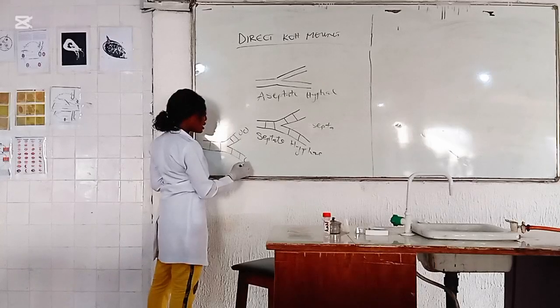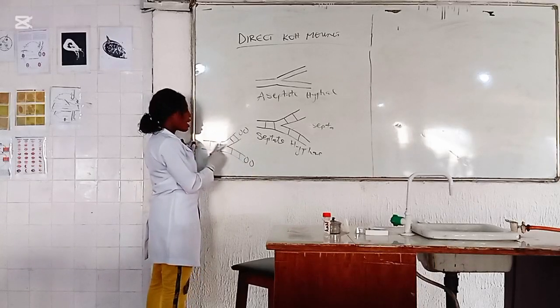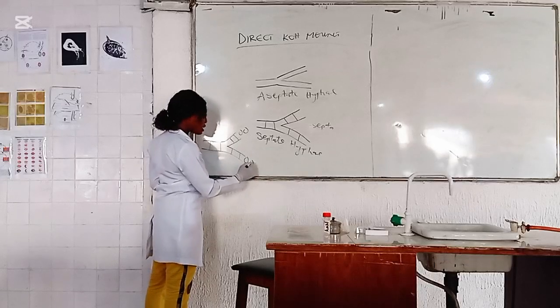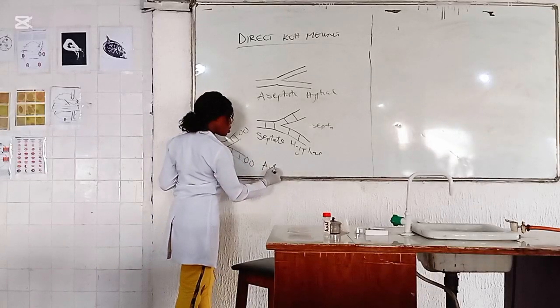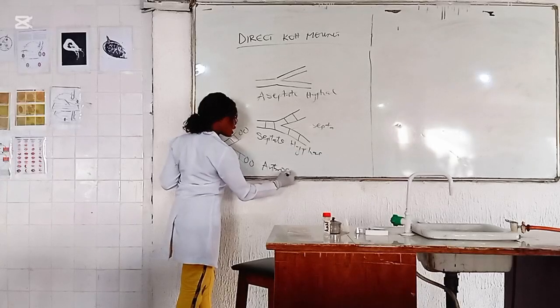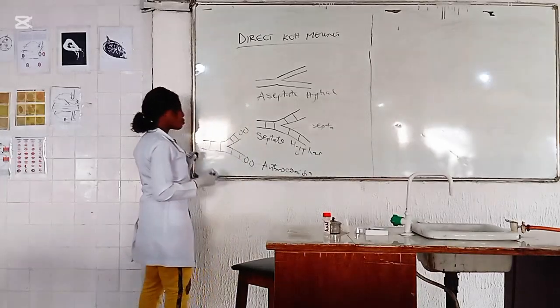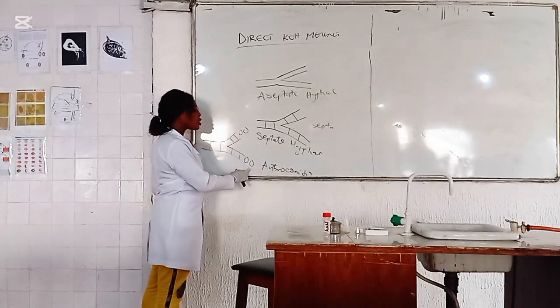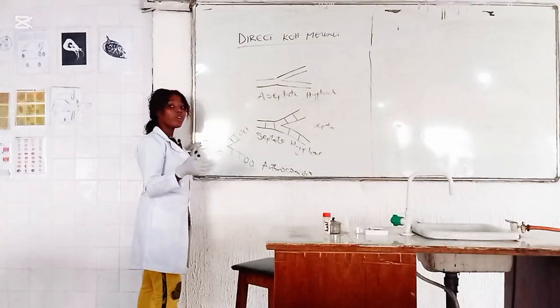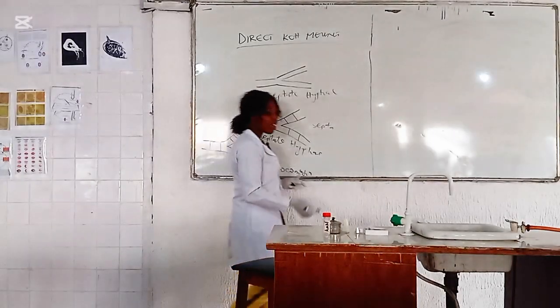When they thicken and separate away from the hyphae, they form this, which is called arthroconidia. So you can actually see arthroconidia in your hair sample. You can see septate hyphae, you can see aseptate hyphae.